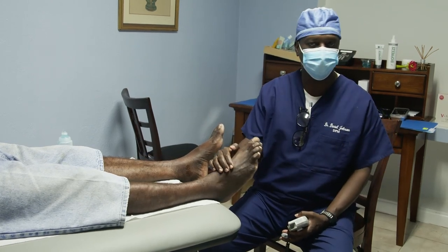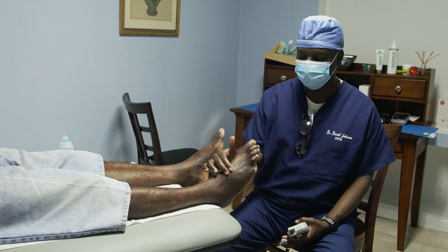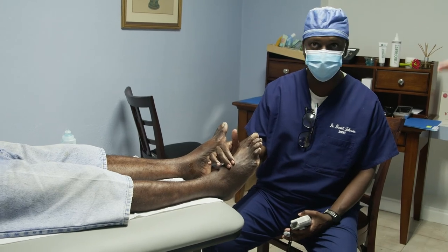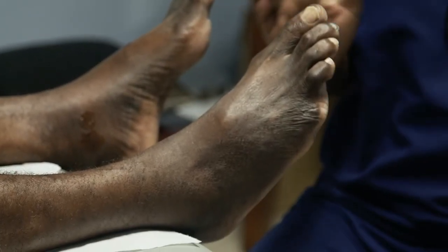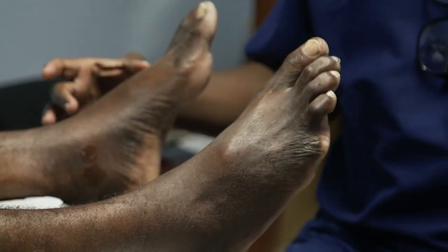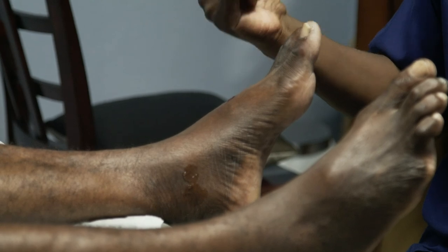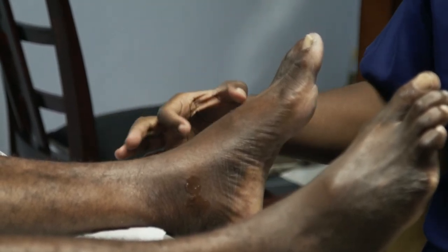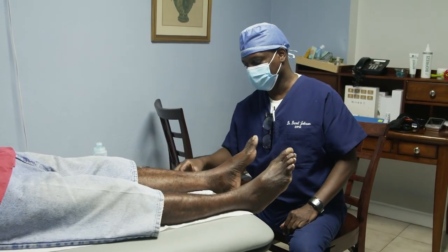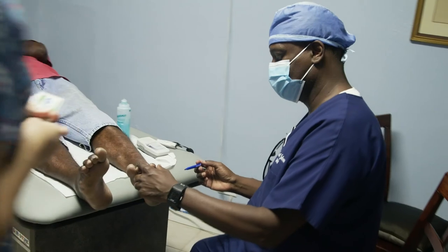Although we're not working on this foot, I still want to feel if I can feel that pulse bounding. Dr. De La Cruz, you can see my fingers? So you see my bounding pulse. There's a bounding pulse on both. Although we're not working on this foot today, that's still nice to know. It's palpable, but on this one I want to make sure by having a Doppler. So we got a neurological confirmation, he has neuropathy. Doppler confirmation, he has enough blood supply. Now we do the markings on the foot where we want to go. And then we're going in there, we'll do the anesthesia. Once the anesthesia is done, we can do our markings now.